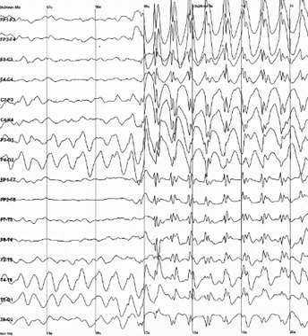It is usually seen in the prefrontal leads, that is, just over the eyes. Sometimes they are seen with mental activity. They are usually in the theta, 4 to 7 Hz, or alpha, 7 to 14 Hz, range. They were named because they were believed to originate from the brain.